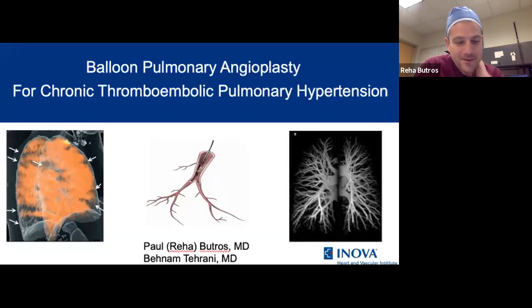Hello, everyone. Today I'll be speaking about a procedure that we've been doing for the last year as part of the comprehensive CTEPH treatment center. We perform percutaneous balloon angioplasty of pulmonary arteries in patients who have chronic PE leading to pulmonary hypertension, with my partner in crime, Behnam Tehrani.